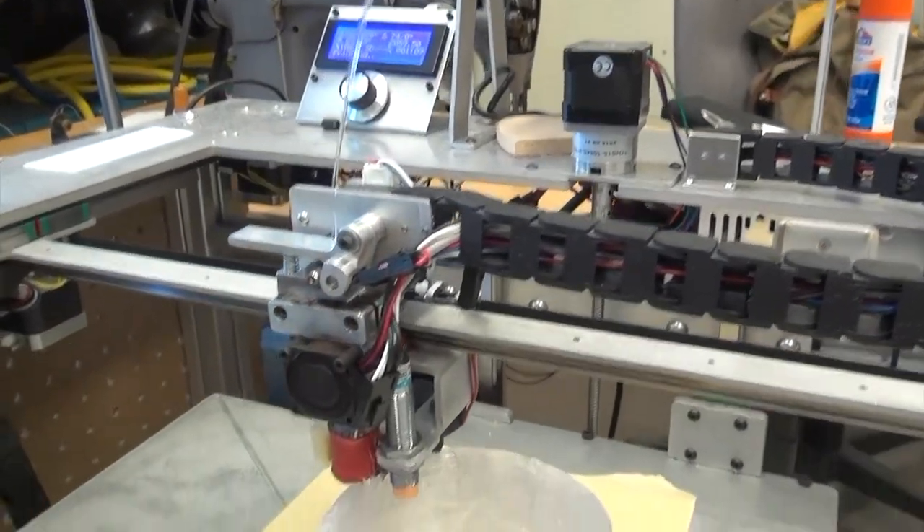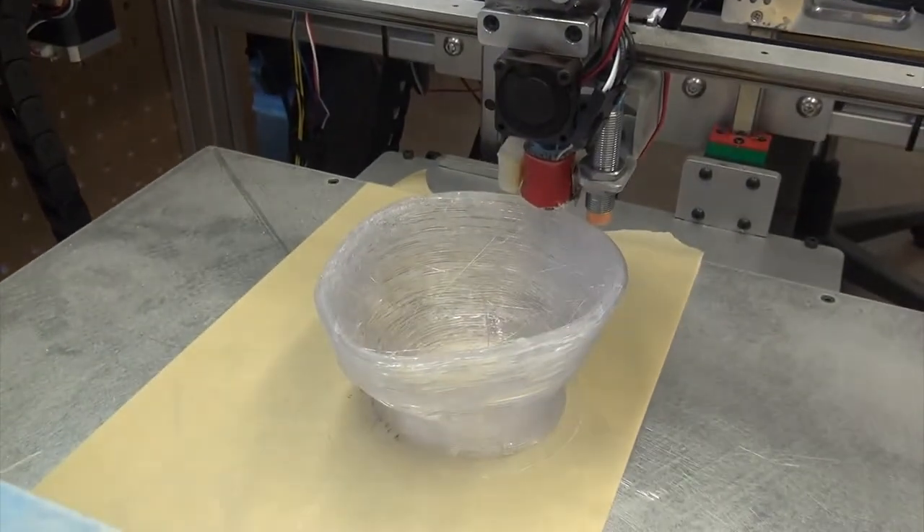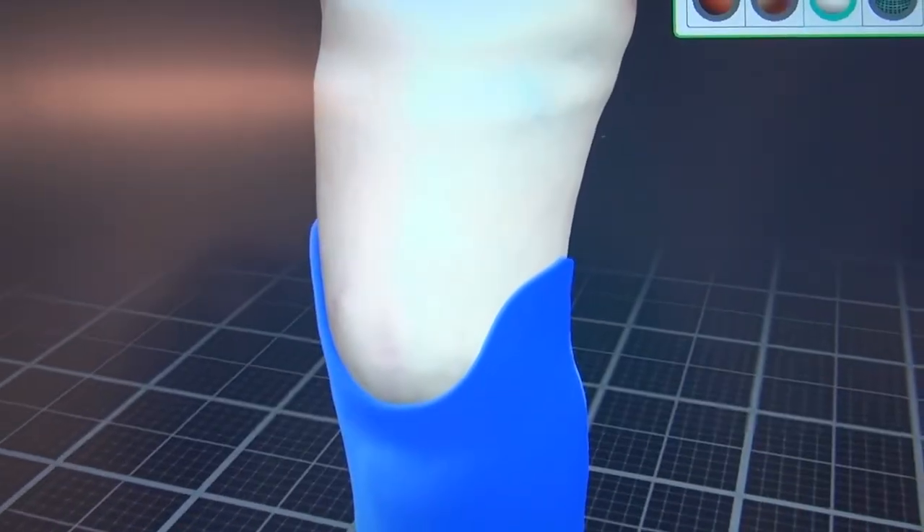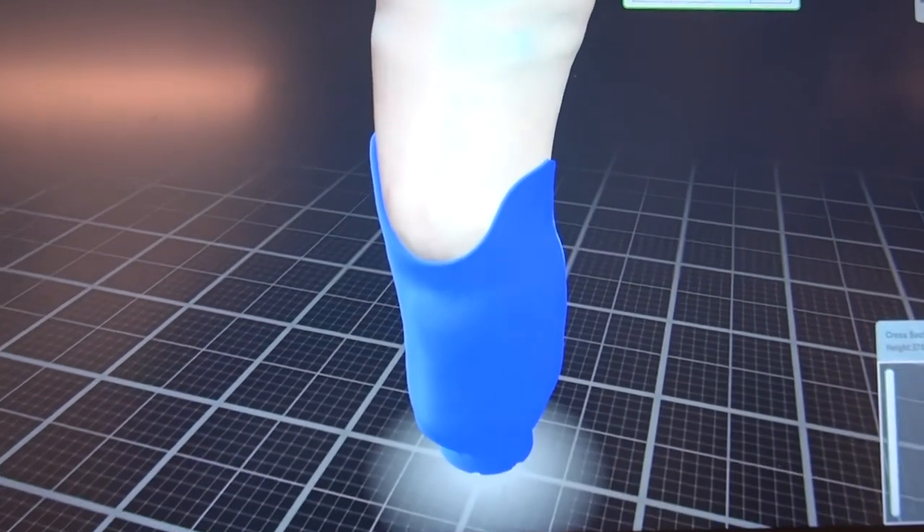That's led to Sunnybrook trialing this — having a 3D printer do the work, creating a digital model of the patient's leg from a computerized scan using a handheld tablet.